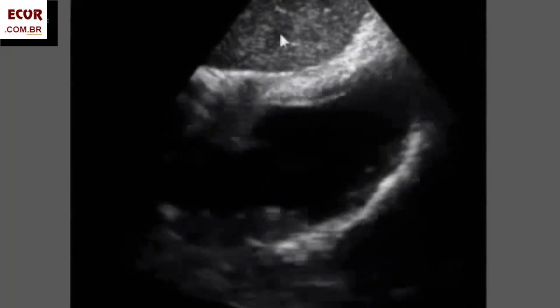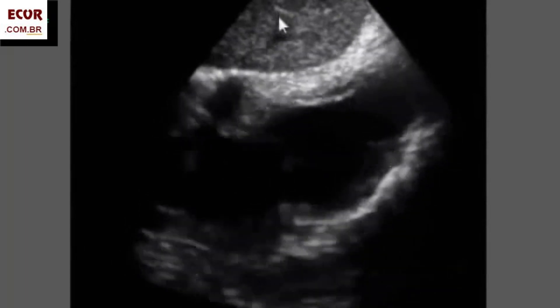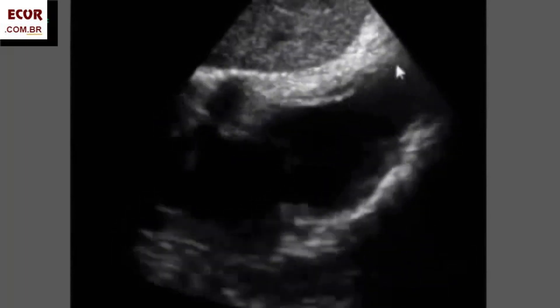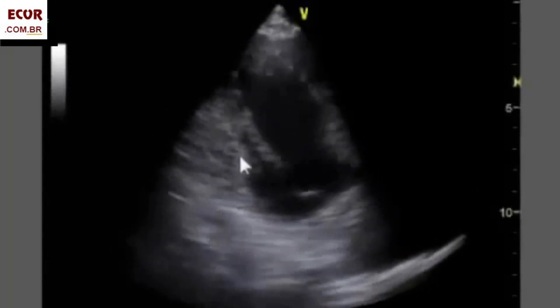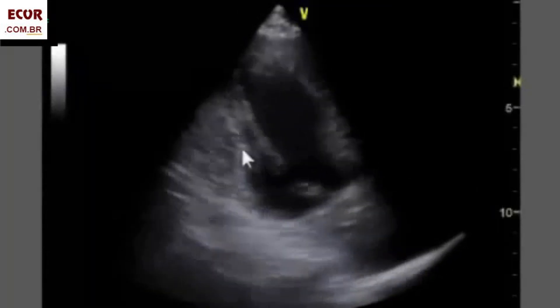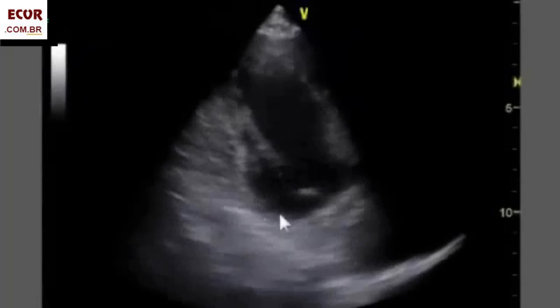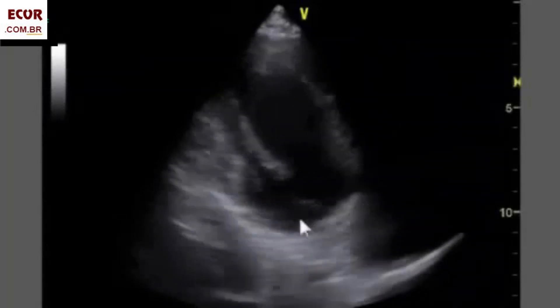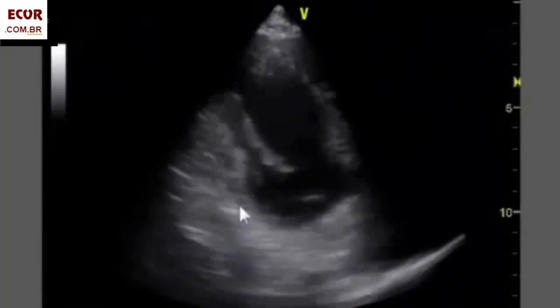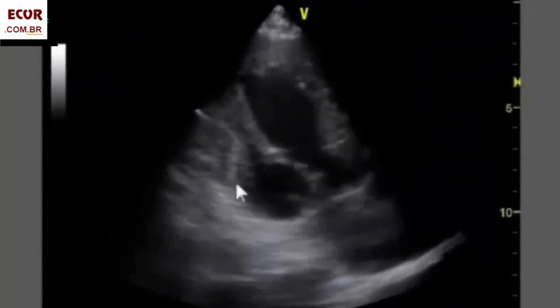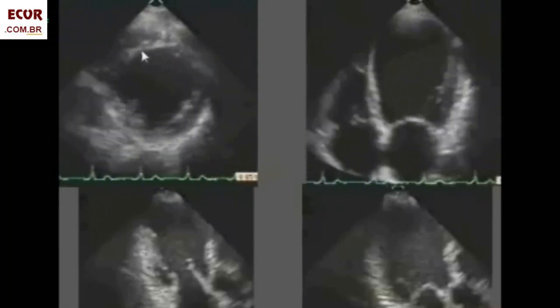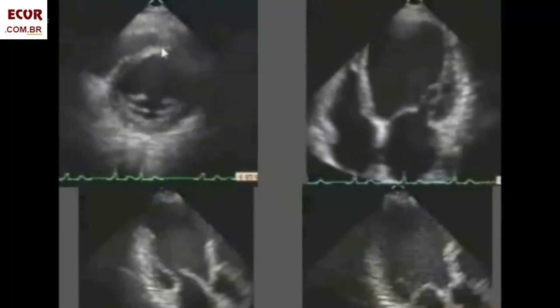Another view of the same aneurysm in the long axis view. Look at the dilatation and systolic expansion of the aneurysm here. Another example involving one-third to half of the inferior wall of the left ventricle. You see that the wall here is very thin — so it's fibrotic, and it's dyskinetic. It expands during systole. In this case, we can see fibrosis in the area of the anterior septum.